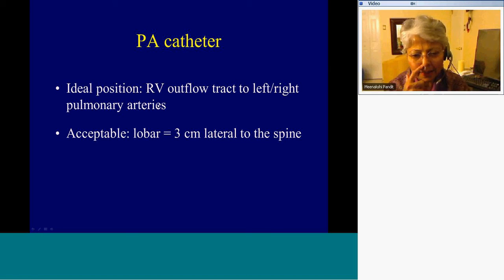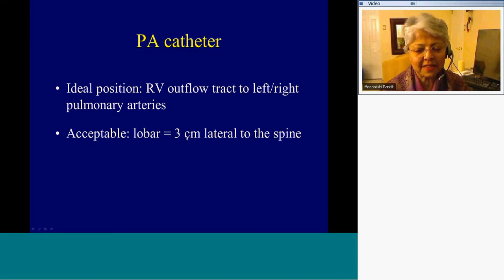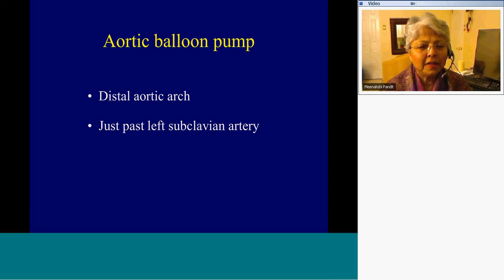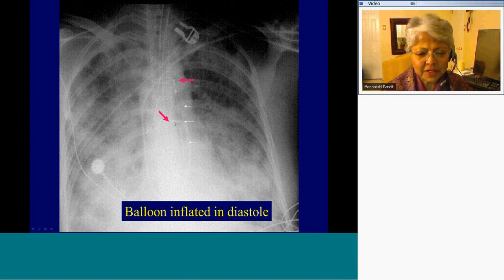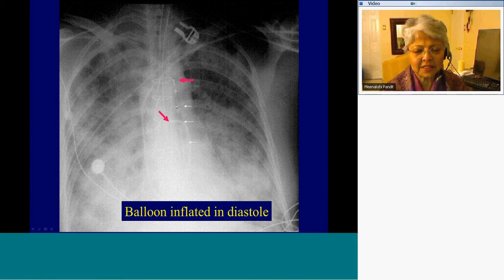PA catheters are ideally placed from the right ventricular outflow tract to either the left or right main pulmonary arteries, and are acceptable up to the lobar arteries — about three centimeters lateral to the spine on either side. The intra-aortic balloon pump is ideal in the distal aortic arch just past the left subclavian artery. This is a pulmonary artery catheter in the right pulmonary artery — that's a good position. And this is the tip of the aortic balloon pump in the distal aortic arch; you can see the lucency of the balloon, so this radiograph was obtained during diastole when the balloon is inflated.